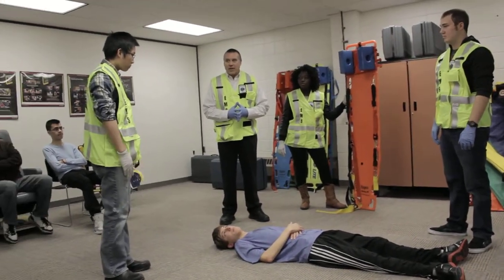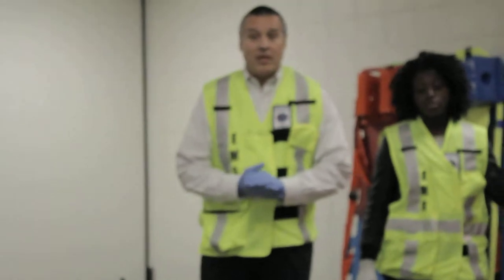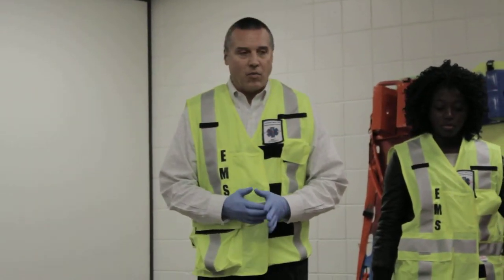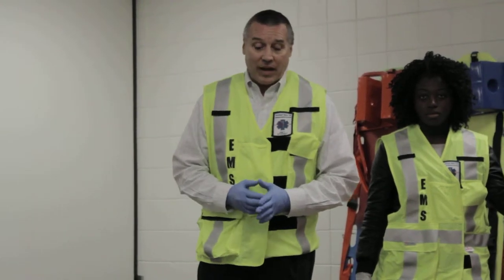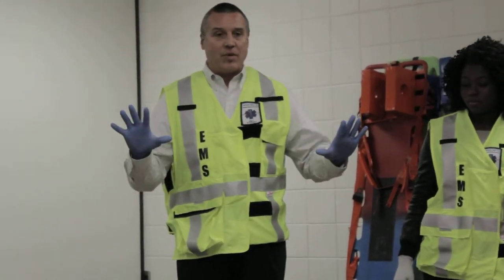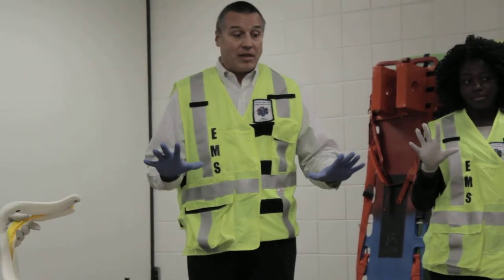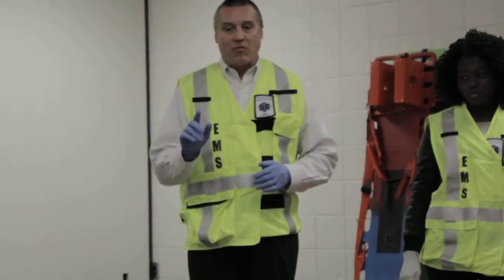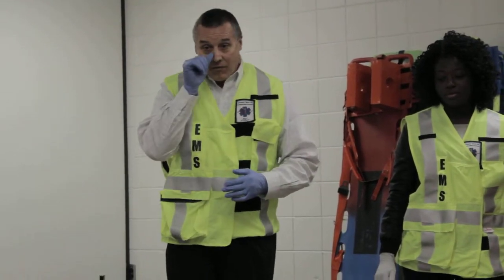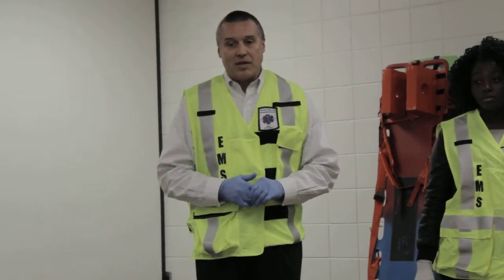We're here at Northeast Metro 916 EMT program, and we're going to demonstrate spinal immobilization of a supine patient. Our first action — we have our BSI. I'm going to make sure that the scene is safe for us to enter. We have one patient. The patient has been injured falling off a ladder, injuring his neck and back.